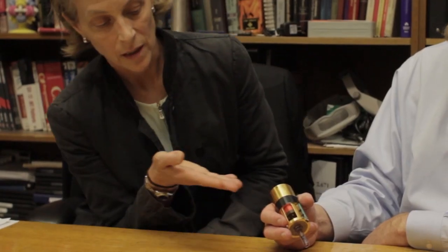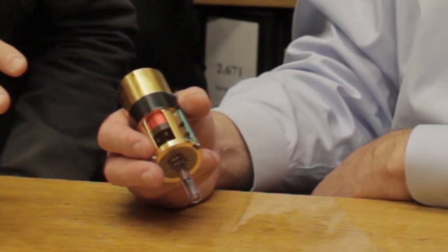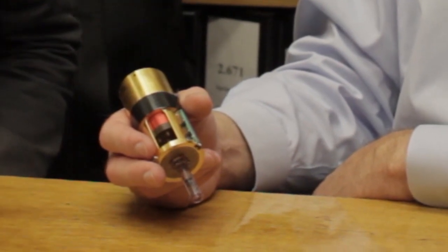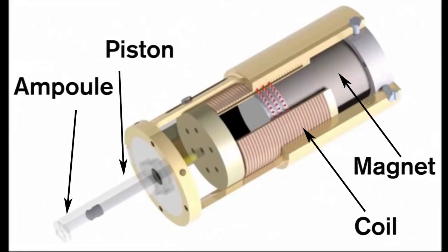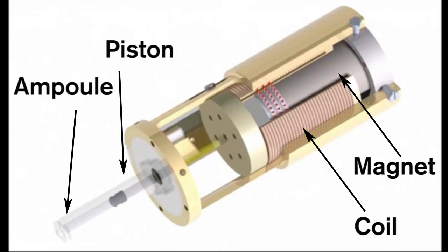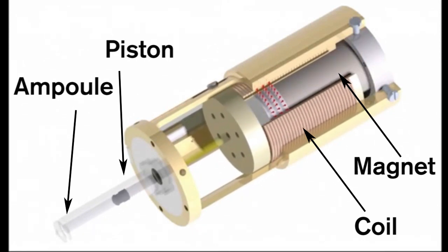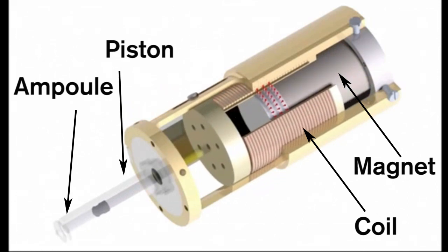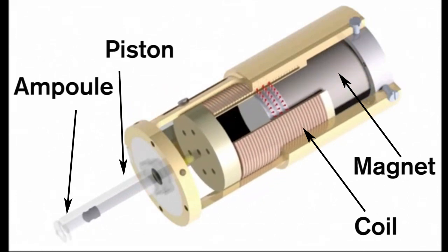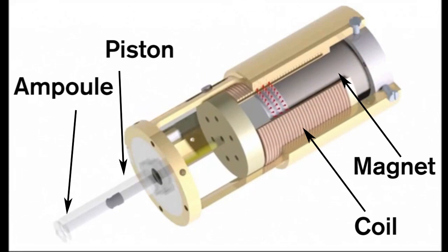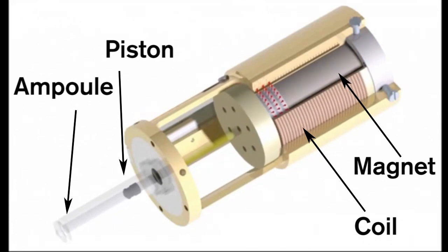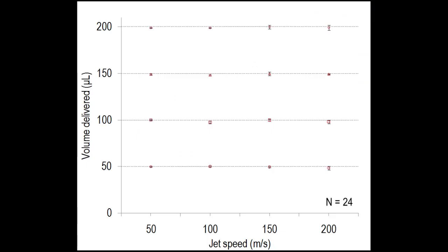So here you can see the heart of the Lorentz force actuated, the heart of our actual technology. There's a magnet in the centre of the jet injector that's surrounded by a coil of wire. And when we apply a current to the coil, we create a Lorentz force that pushes this piston, which forces the drug out of the ampoule.